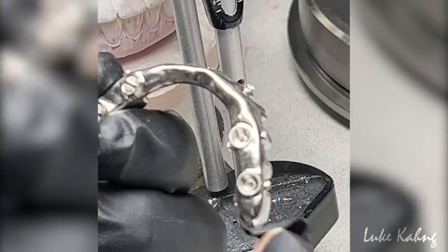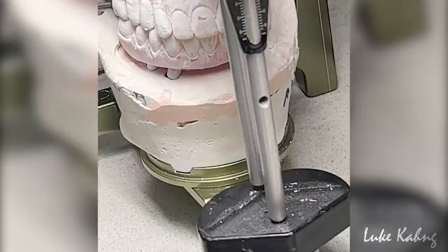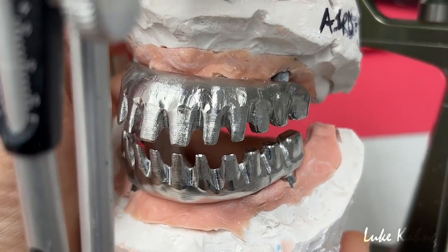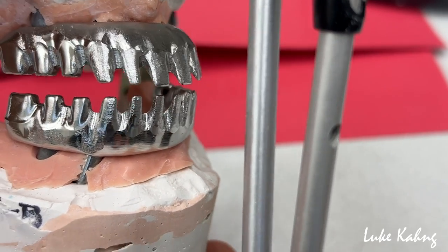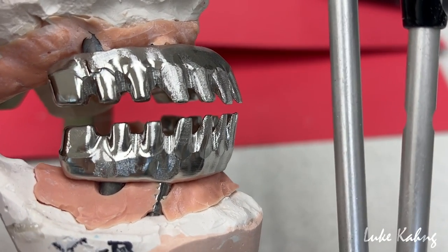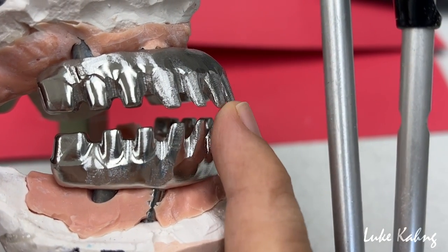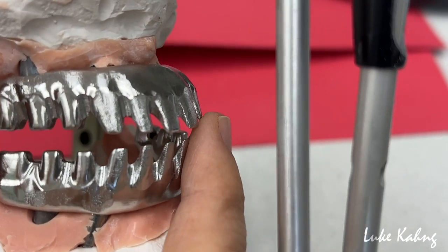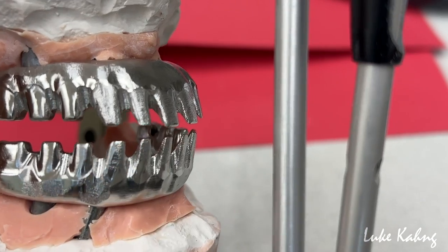Kind of pricey, but it's a lot of work with a lot of milling spots, and then we're going to show the final stuff. Okay, so after finishing the frame design, this is the final one. See, finally we grind quite a bit of the facial area, trying to make almost edge-to-edge occlusion. Okay, and that one is the final.